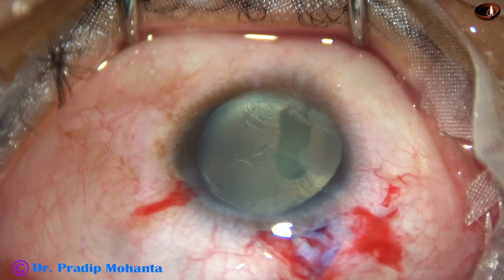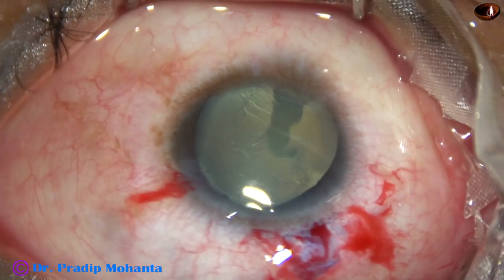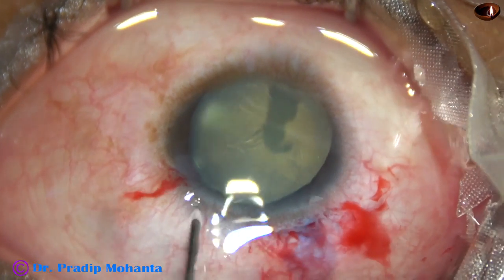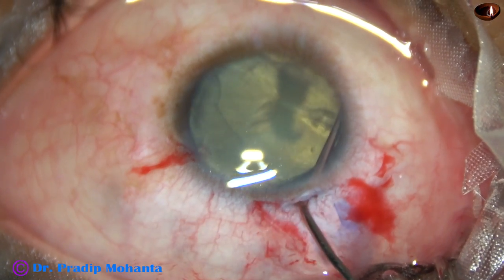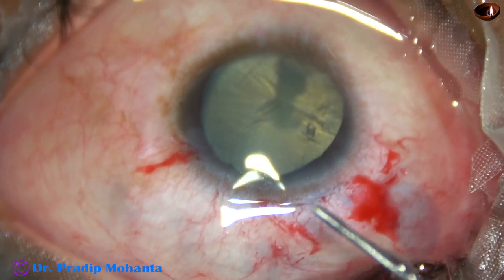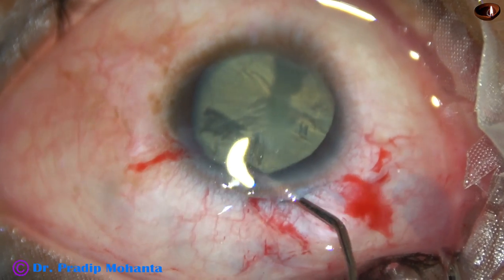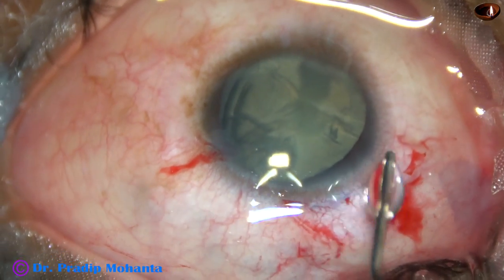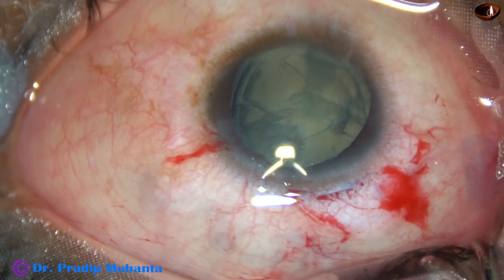There is no zonular attachment seen on the visible portion, which indicates that the capsular bag is of normal size. There is no zonular dehiscence, particularly in the coloboma area. That is a good thing and will help me in surgery. If there were some zonular dehiscence, I may have had to use a CTR, which was not necessary in this case.